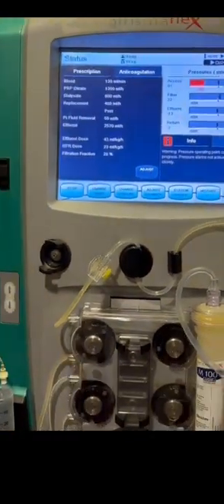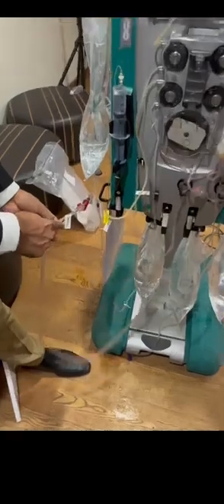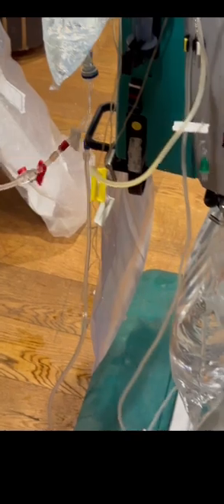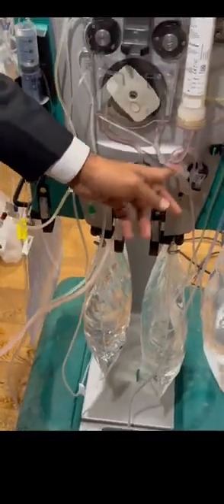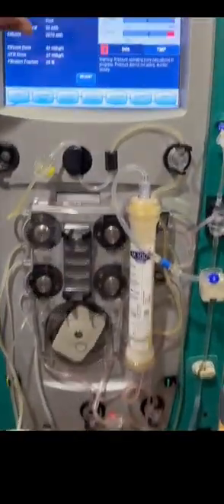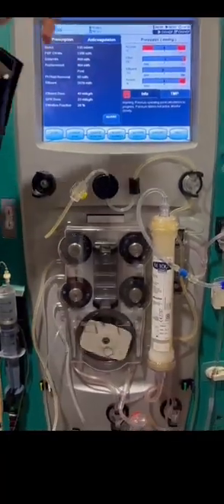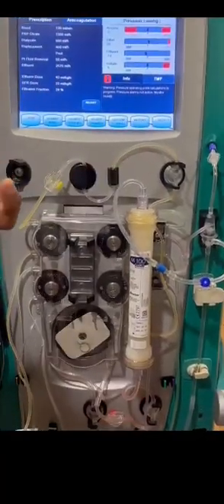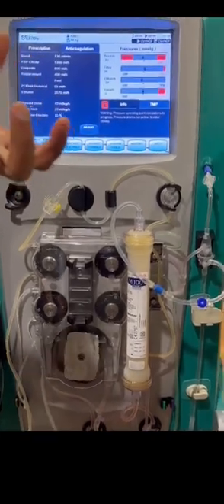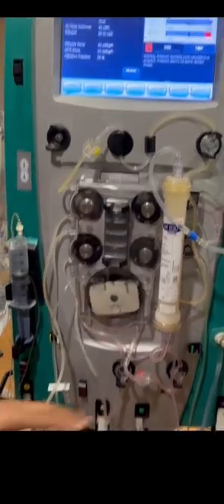So this is the access line which is coming from the patient, the red line. This small line I will tell you in between. Now you just see this red line. Okay, blood is coming. It has come to the access pressure port. Access pressure is usually negative. In our estimation also, but we are not monitoring. If you are monitoring that, we will come to know the exact patient negative pressure, and we can manage some fistulas also. But we need a separate tubing for that. So this is access pressure.